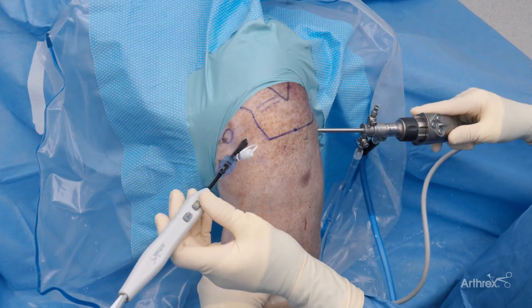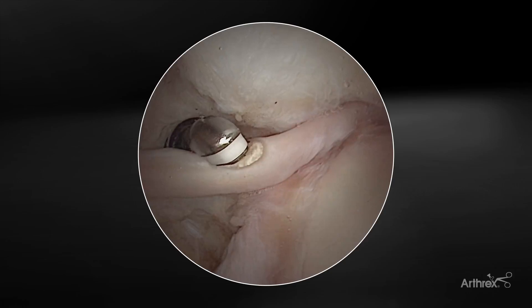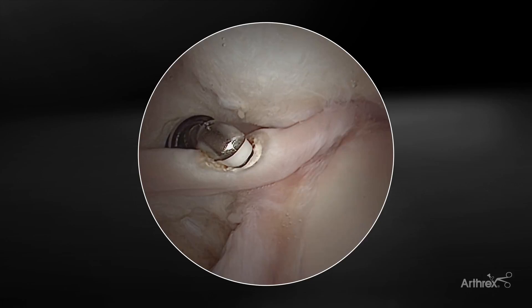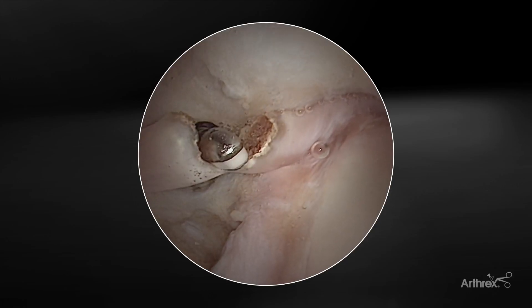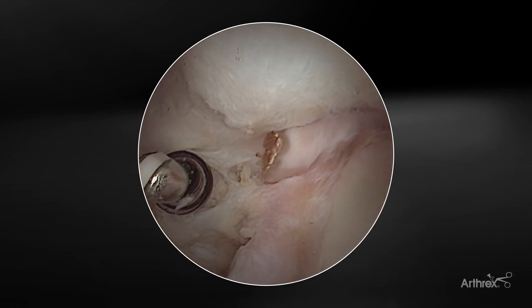In preparation for a subpectoral biceps tenodesis, the i90 is very efficient at completing the tenotomy in the joint. I usually start about one centimeter off the stump, the insertion, and let the i90 do its work. Very clean, very efficient — a quick tenotomy in preparation for a tenodesis.